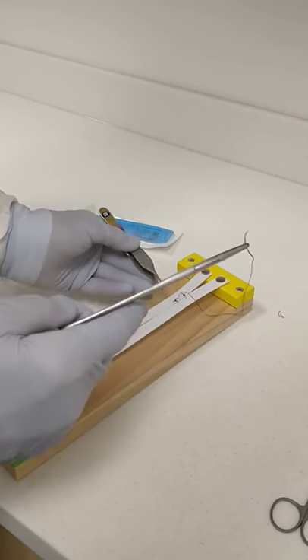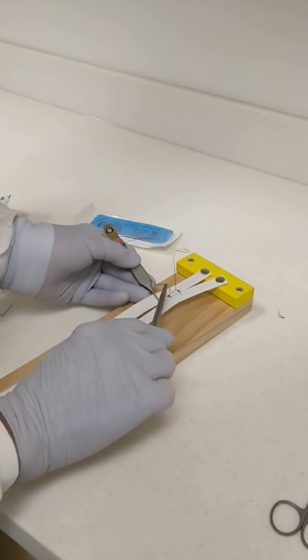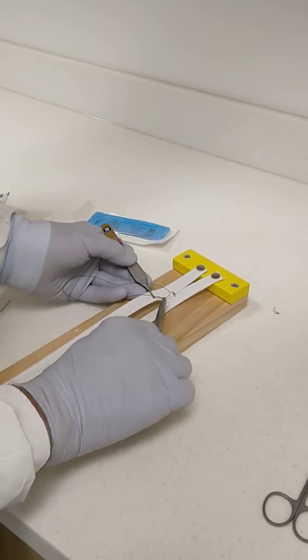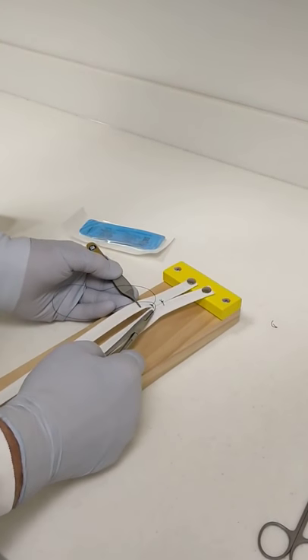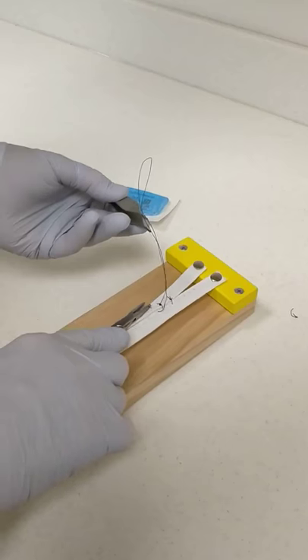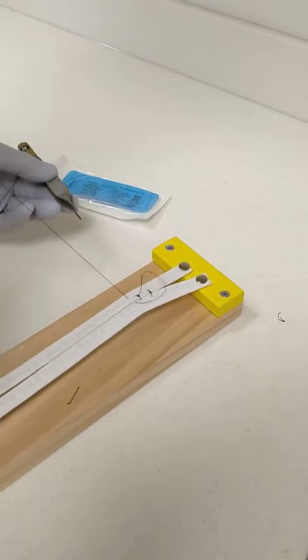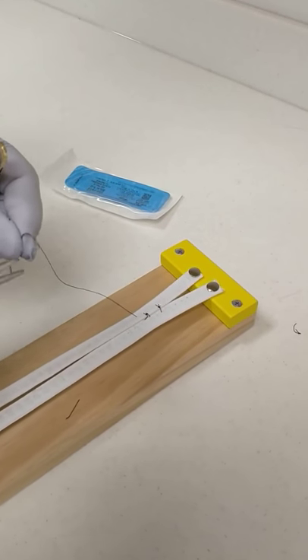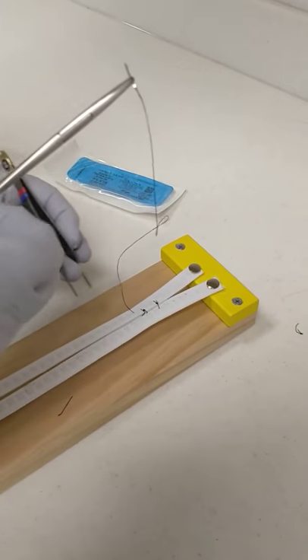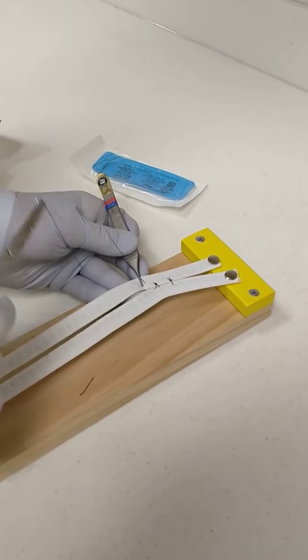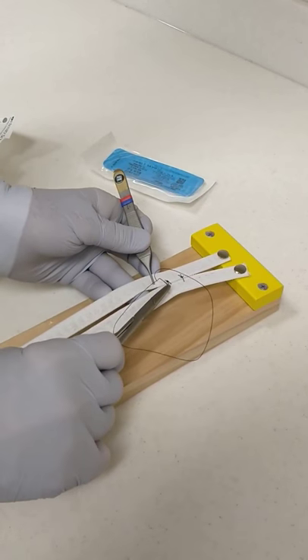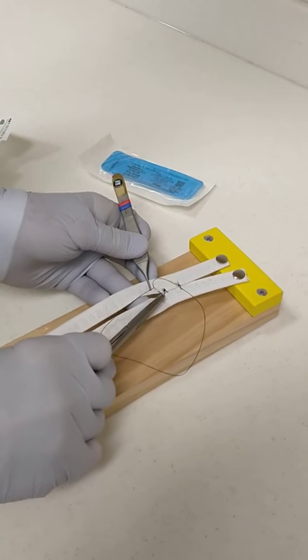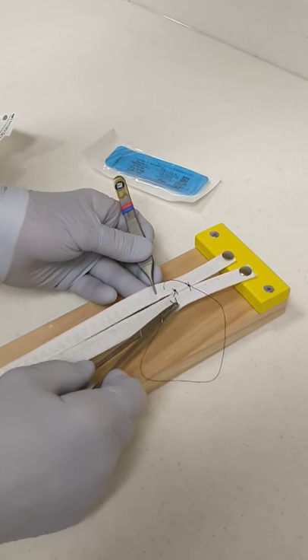And then, it's just a simple matter of running the suture like a baseball stitch. Comes through. It goes on an angle initially, and you come back so that the next suture is even with the one that was just placed.